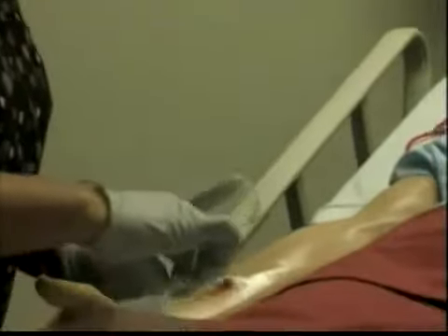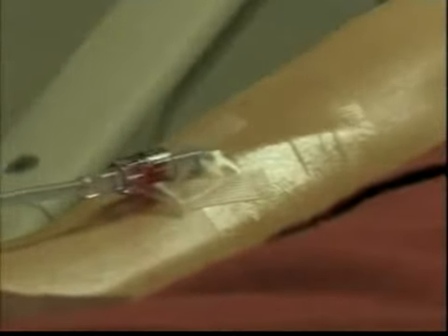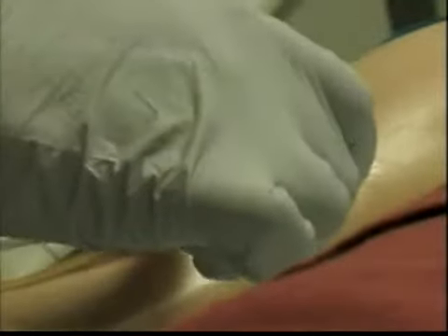At this point, then you're going to have your tape, and you want to get enough of a piece that will create a U, something about this long. You cut it, you get 2, see how I did it? So now with this part, you're going to get the sticky part up, you're going to go right underneath it, and you're going to catch the extension, and you're going to create a U. You're going to fold it and up, fold it and up. You see how I created a U in there? And with this extra piece, then you're going to cover the contour of the extension and anchor it in place.